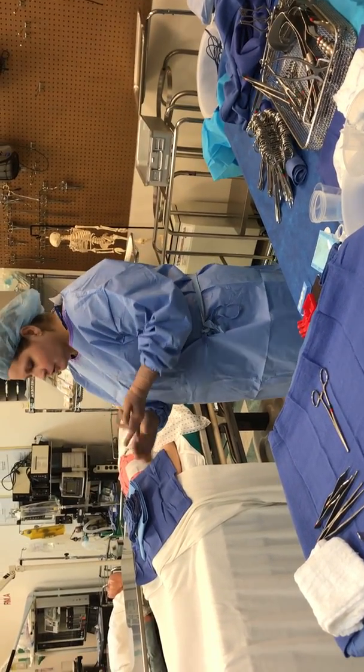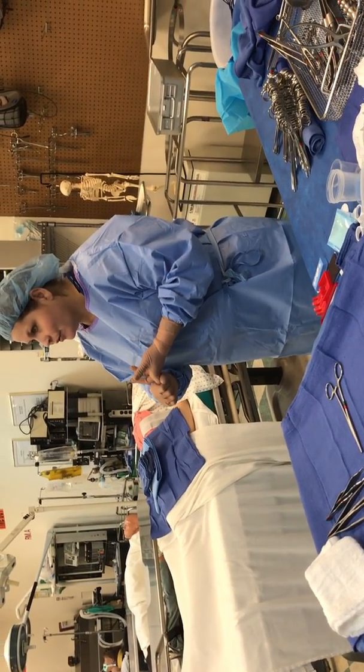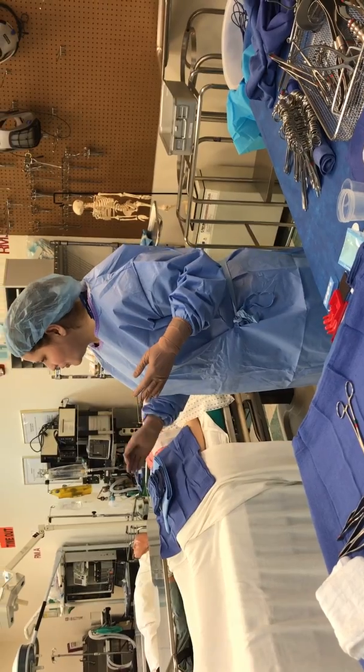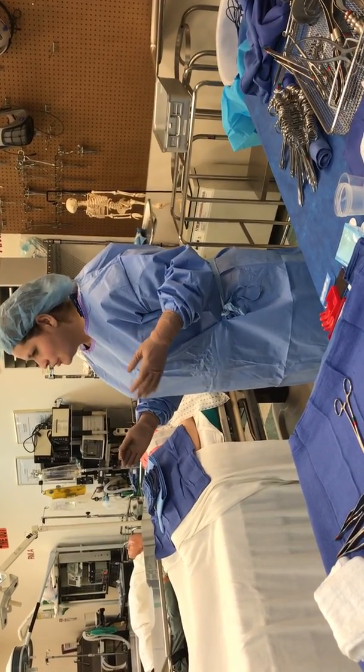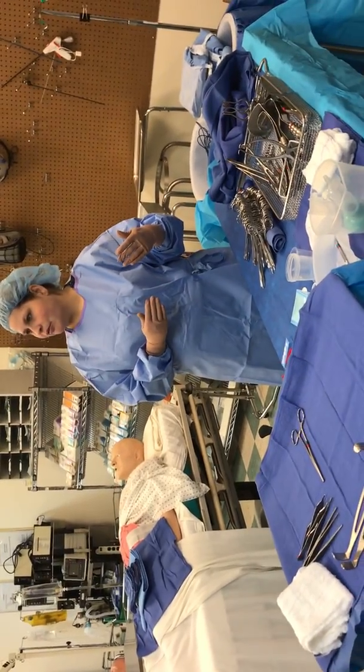You need clamps. You need Kellys. Have a tonsil. Have a right angle. And then you're going to see that a lot of times they're just going to use the same instruments back and forth. So then you limit, and then you take things off from your Mayo.